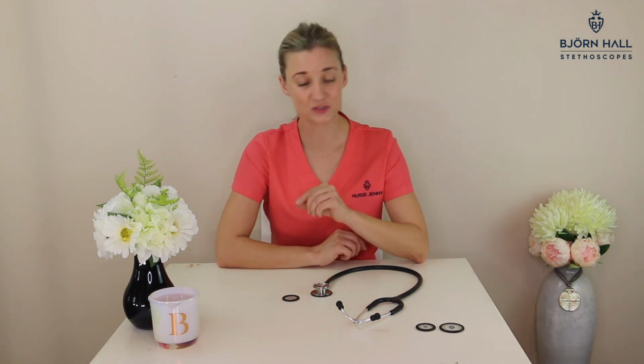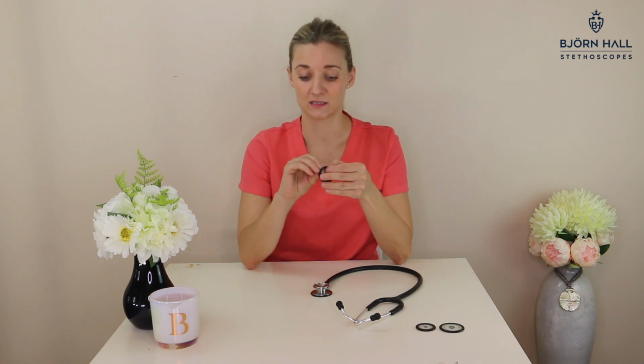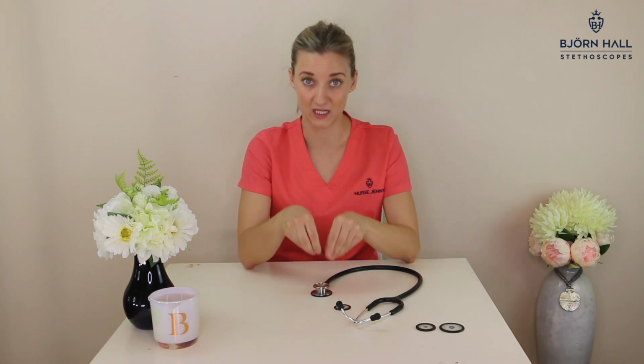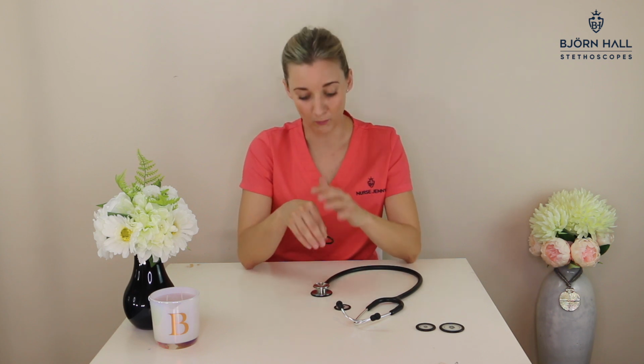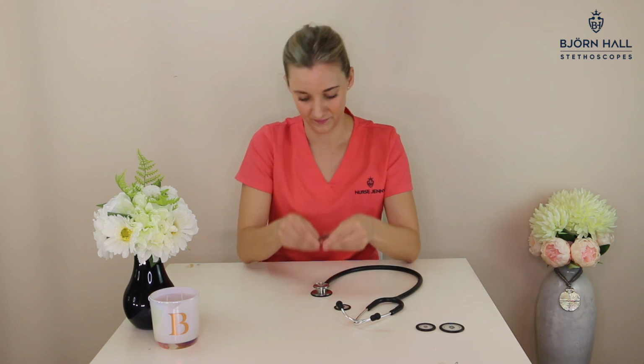Now I've just made that look really easy, but I know it can be quite tricky to get these new diaphragms on, especially the small one. So my number 1 tip is, when you get your diaphragms, pull them apart into 2 pieces so that you have your outer rim on its own. And then you put that onto your chest piece. Now what this will do is allow it to stretch and to mold to your chest piece. Because when you get them, they're quite firm and not so flexible. Leave it on for a minimum of 2 hours, or if you have time, even better, leave it on overnight.